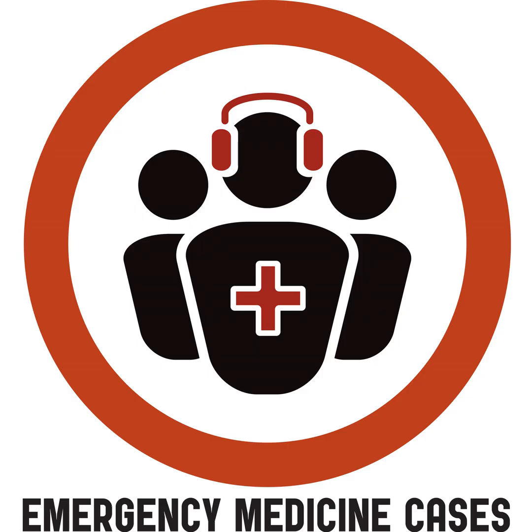All right. So a lot to review there, just to orient people to where we are. We've talked about preparation, we've talked about pre-oxygenation, and now we're talking about the sequencing and how it's different in the COVID era. The first thing is you need all your necessary equipment within reach. 2 bougies, one for crike and one for VL. You need your blades, your supraglottic airway, suction, etc.